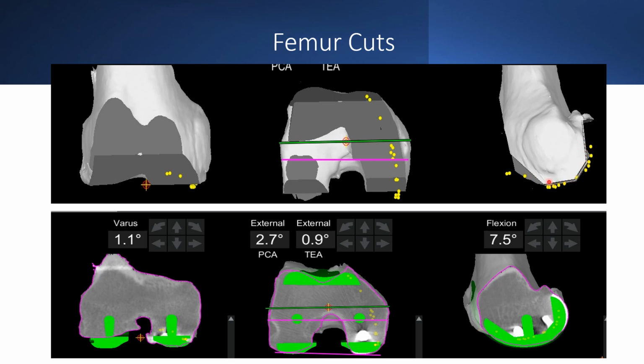And so you can see here's the remaining bone. The implant has been adjusted so that it goes below the level of that defect into an area of healthy bone. So the femoral component will be resting on healthy femur. Nice thing about this is that all this can be visualized virtually prior to the implantation of any permanent components.